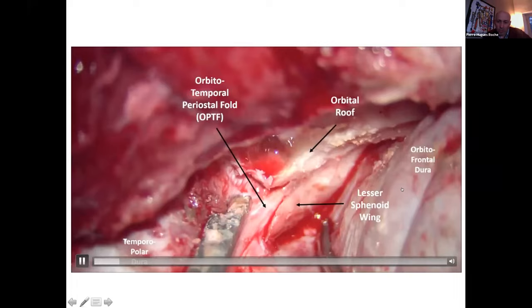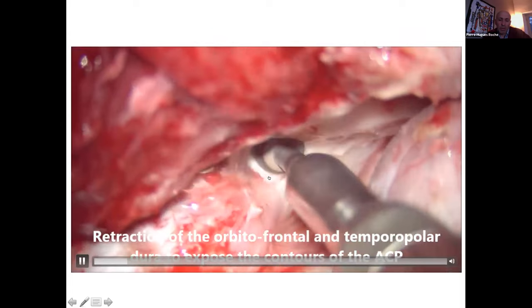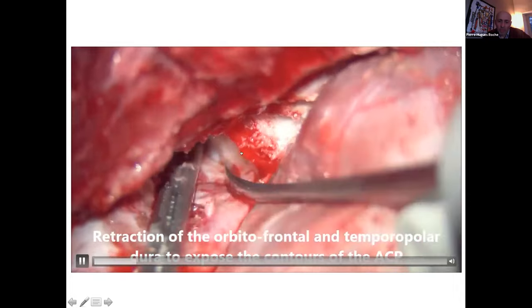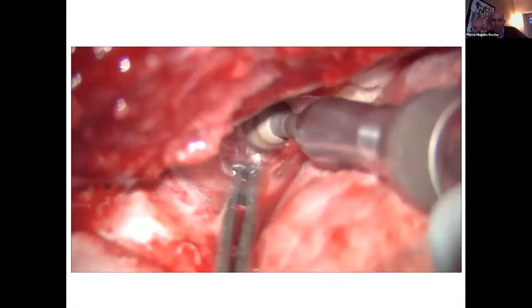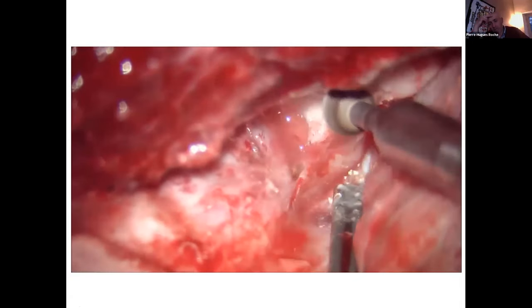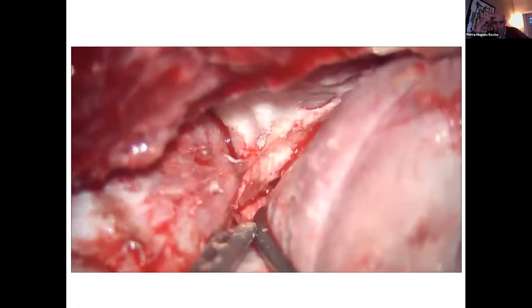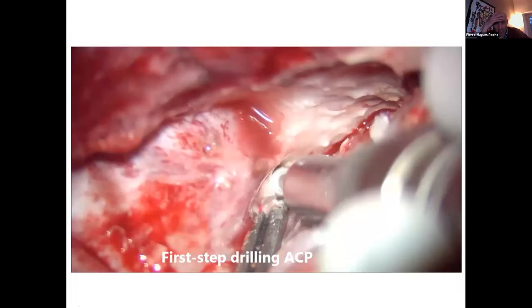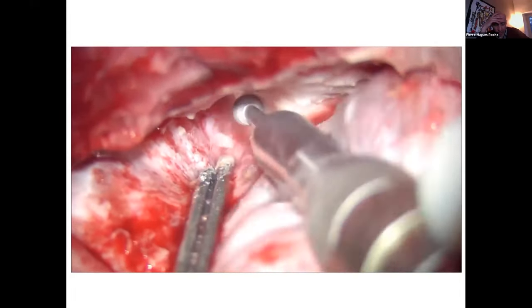You have to expose the frontoorbital dura here and the temporopolar dura here. One of the key points is to drill the lateral wall of the orbit and the floor and the roof of the orbit, and to elevate gradually the dura, altogether the frontal dura and the temporopolar dura. Please pay attention to the drill you use. Usually I always use a 5 millimeter diamond drill under copious irrigation in order to not damage the periorbita and to avoid any thermic trauma of the optic nerve, particularly at the level of the ACP.